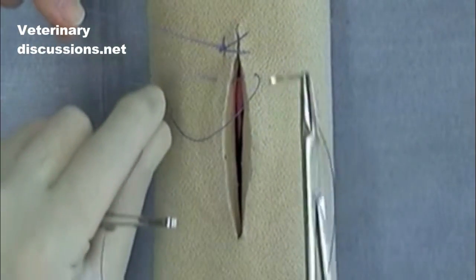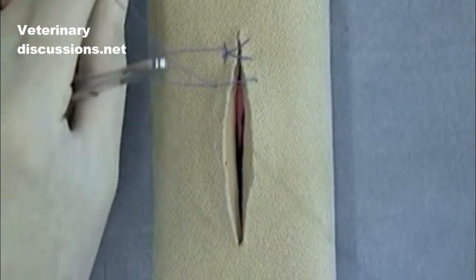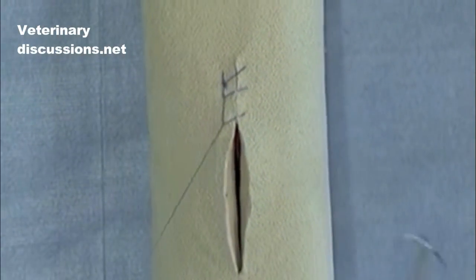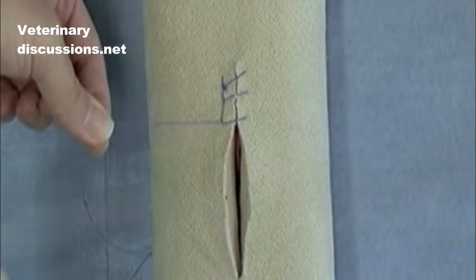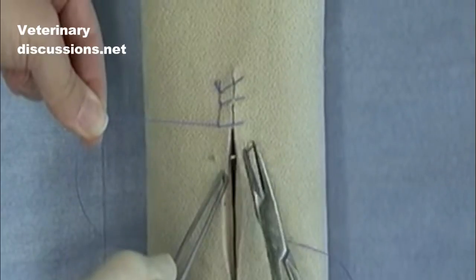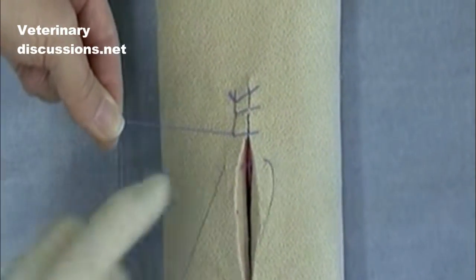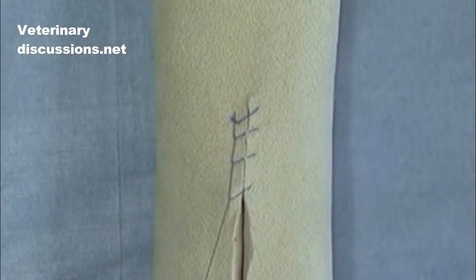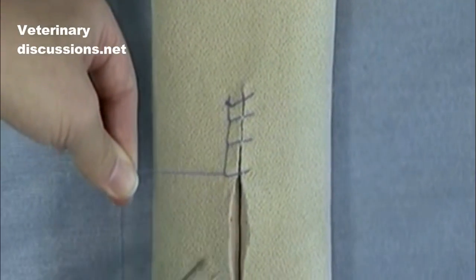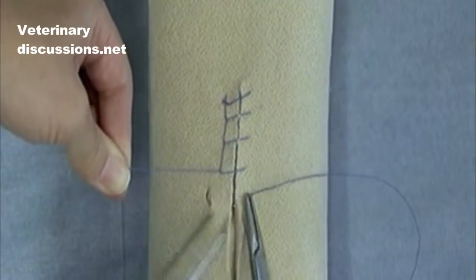Notice that each bite comes inside the loop of suture being held by my surgical assistant. You can see here that very nice even tension on both sides of the incision.